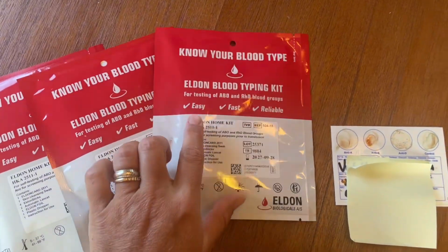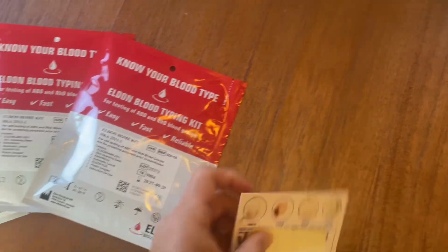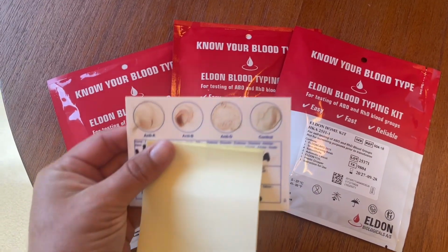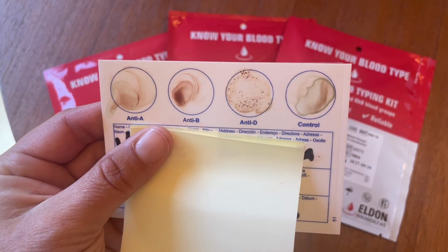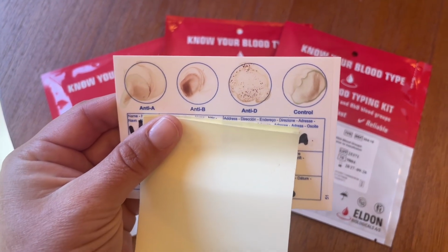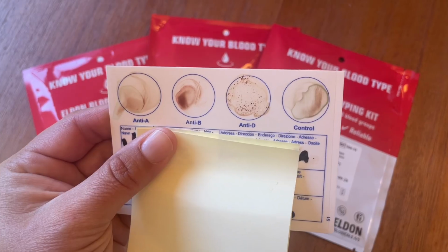As it says here, these are easy, fast, and reliable. This was a very fast test, but I am going to tell you that I ended up having to use 3 tests on one person because we followed the directions, but it didn't seem to really work properly. This was the 3rd test, and we were able to determine that this person was type O positive, but the other 2 tests actually came out a little bit differently. One of them came out type O negative, and then the other one came out where we couldn't really figure out what the blood type was.